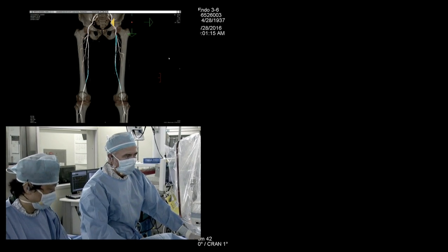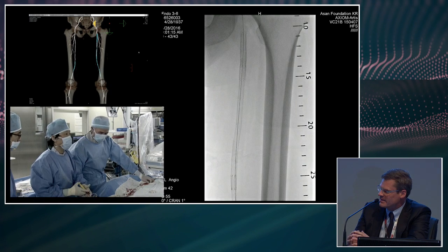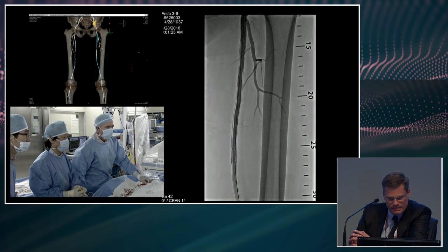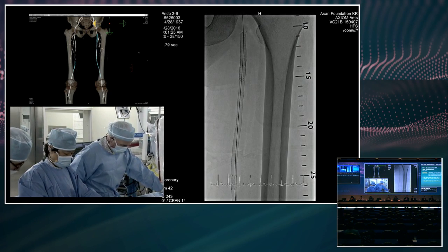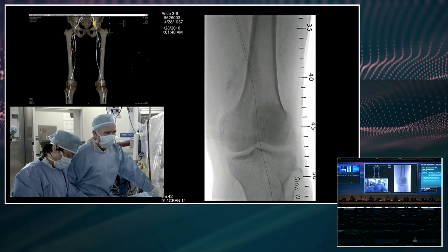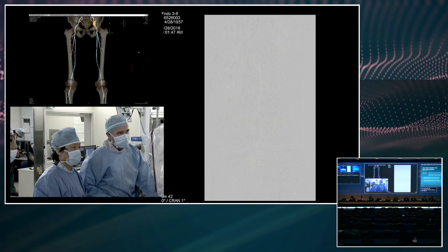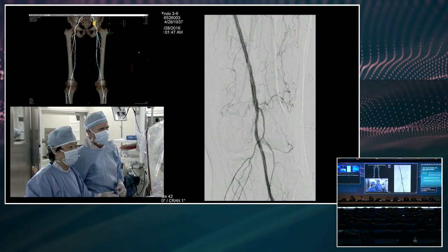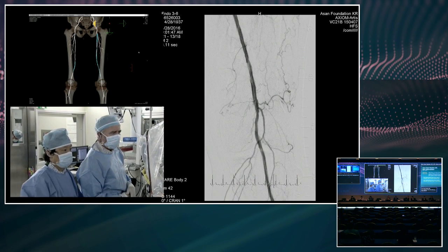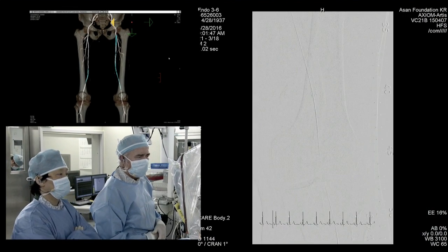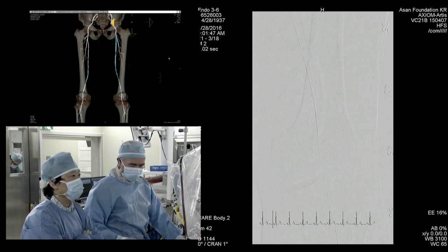The ISR segment looks good. The distal native segment is okay. There's a little haziness in the distal part of the stent — we'll go in and do a long inflation and then probably call it a day. I don't think we're going to need a stent here. We'll go to the other room and then perhaps come back. Let us know when you're finished.